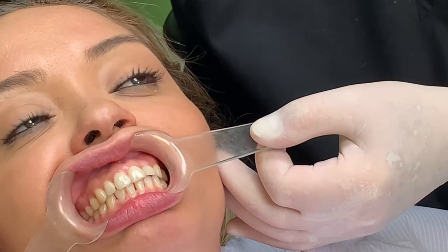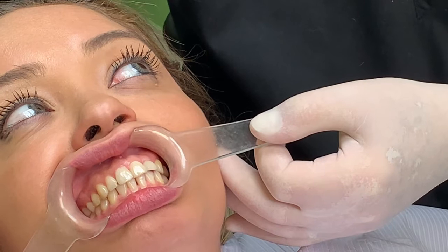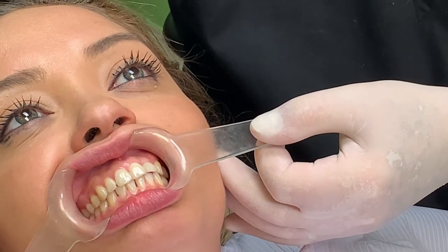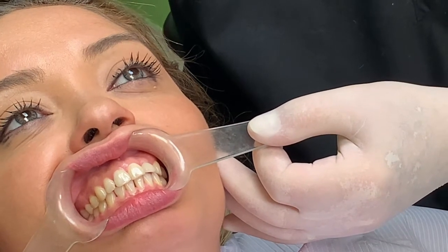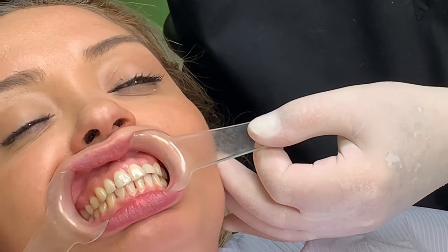I have already completed an oral and jaw joint exam and found that Gloria is normal in every respect. Now, I'm going to begin the fitting by showing you how I bond two of the eight brackets. Bonding the others is exactly the same.